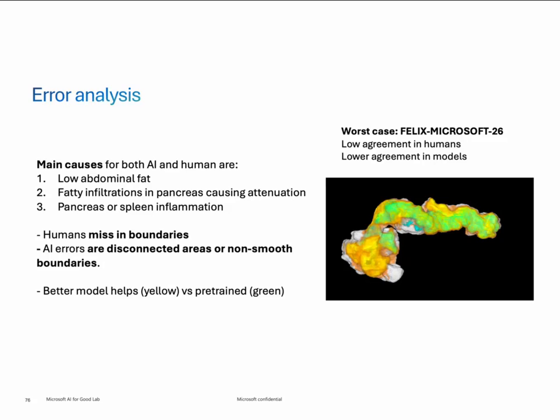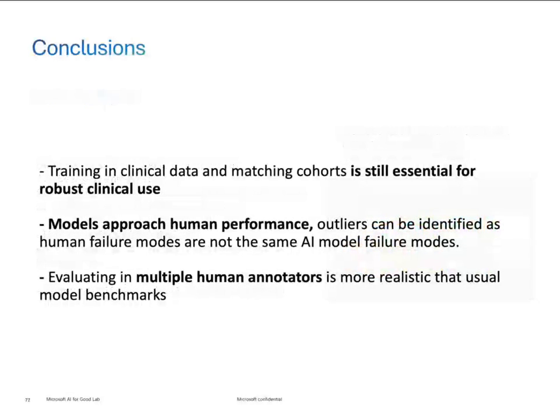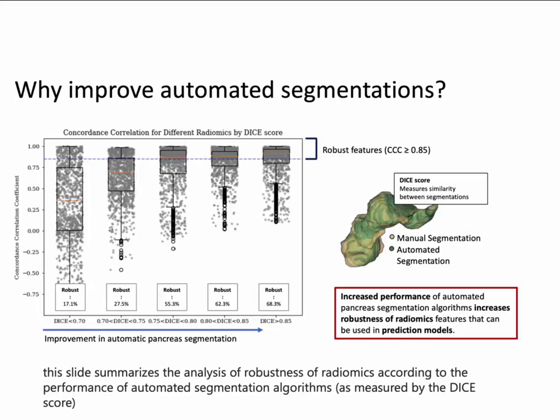The issues tend to be in patients who have fatty infiltration of the pancreas, patients who have poor abdominal fat planes, or where there's inflammation near the pancreas. But again, if 95% of the time the computer is correct and it tells you when it has a problem, so you could do the 5%, that's going to save a lot of grief. And the article shows how we're getting better. We'd like to take that 5% and decrease it to 0%. Maybe we can do it, maybe we can't, but at 95%, it will change how we do things.